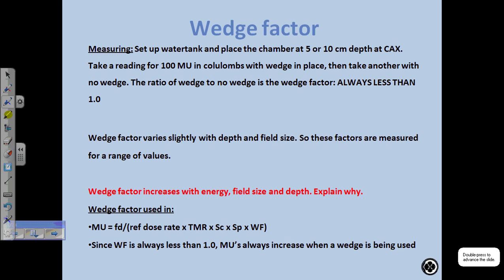So wedge factor varies. It increases with energy, so it goes up. It's never going to reach 1. And it increases with field size and depth. So let's figure out why that is.